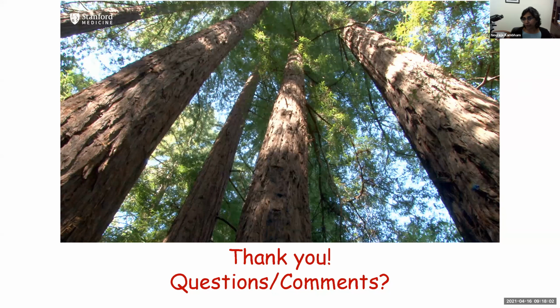That's one I would put as two separate diagnoses. And short of that, if both of them are equally present, I like to talk about it in the comment section, and those are the cases where the comment is going to be long. Yeah. So I think that's all I had. I touched on that earlier.